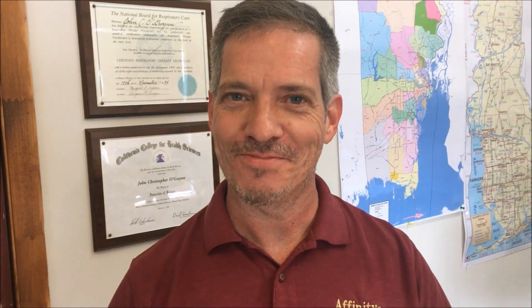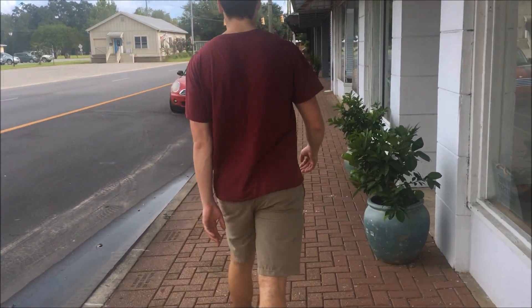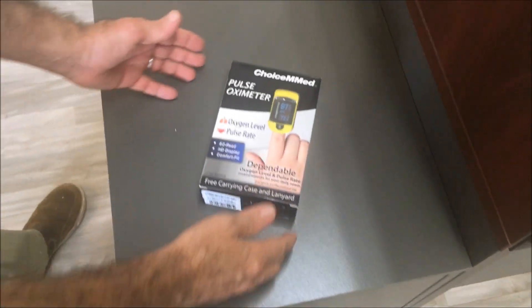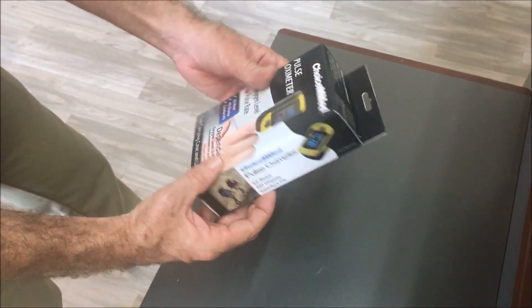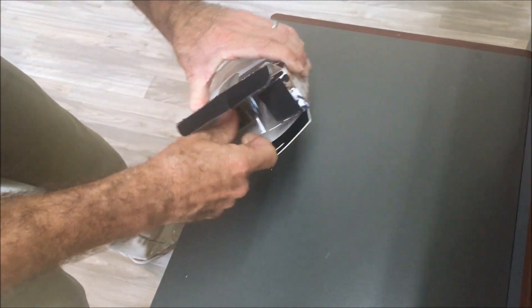Now I'm going to show you a couple of ways that you can use your pulse oximeter — exercising in the gym, taking a walk down the road, or using supplemental oxygen. This is the finger pulse oximeter that we supply out of affinityhm.com. It's very low cost, works so well, and you do not need a prescription for this.